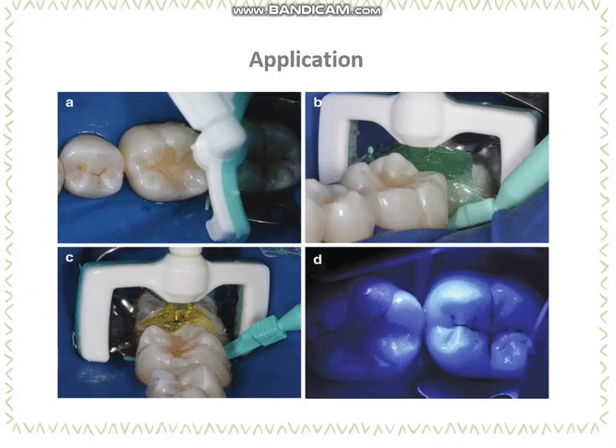How is it applied? First, we need isolation. A good isolation is essential, as the initial phase uses a strong acid for etching the tooth, and this is done by a rubber dam. Preparing the surface by cleaning it with a gel is the next step, which contains 15% HCl that prepares the cavity for the resin infiltration.